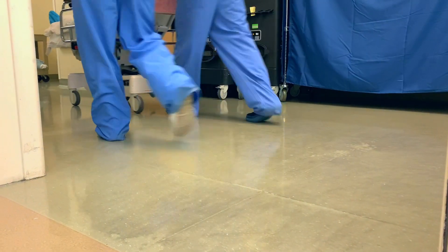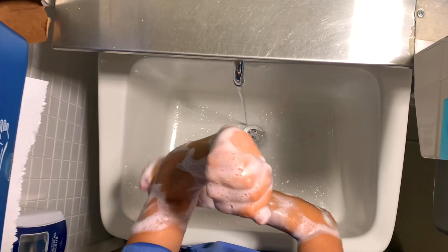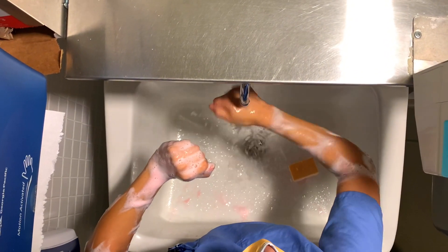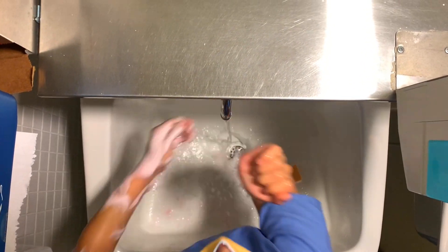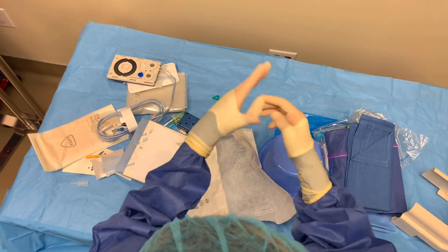Cataract surgery goes incredibly well 99% of the time. We spend countless hours preparing for the surgery so that everything goes to plan, but just like life, not everything goes as we expect 100% of the time.